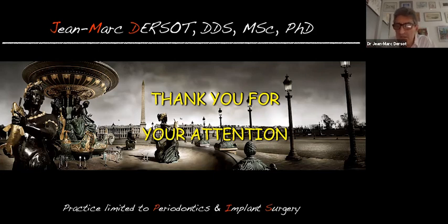And they show you the result 6 months after, 1 year after. But you have seen in one of the clinical cases I have shown, 6 years after, it seemed that the crown on the lateral incisor was in a more buccal direction. So definitely, I think that maybe we have to reconsider the fact that implant is the best solution for the anterior upper jaw.